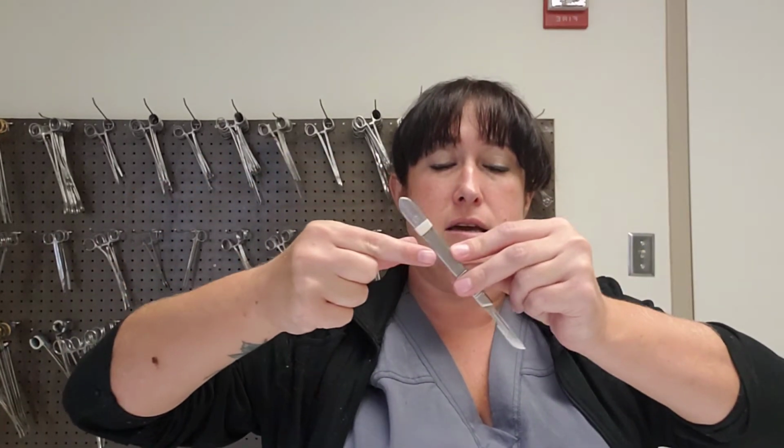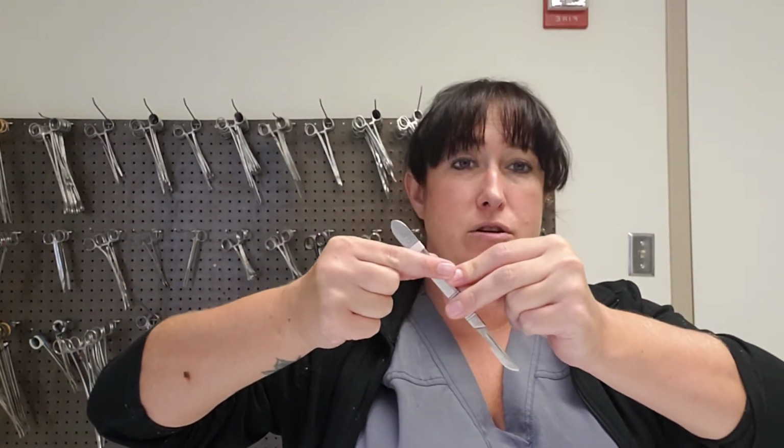Some hospitals will use something called the neutral zone, and it's this area between the surgical technologist and the surgeon and their assistant, where you wouldn't hand anything sharp directly to their hands. You'd actually set it in a basin between you and the surgeon, and you would set that sharp instrument in the basin, and then they would pick that up, and it's called the neutral zone, where there isn't more than one person touching a sharp at a time.